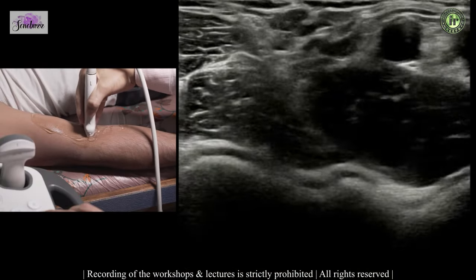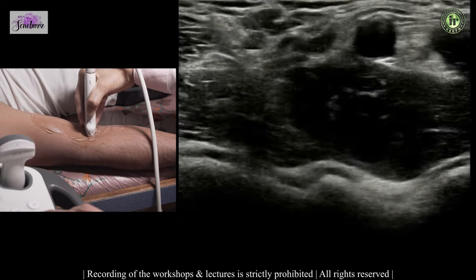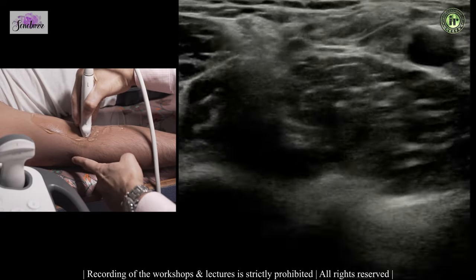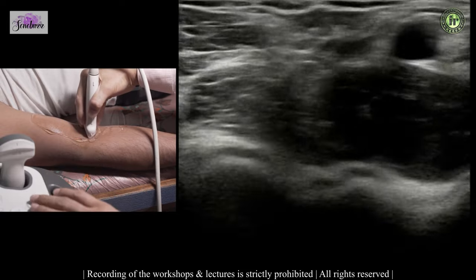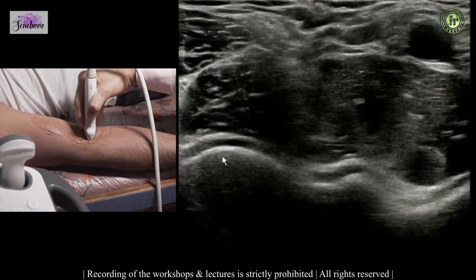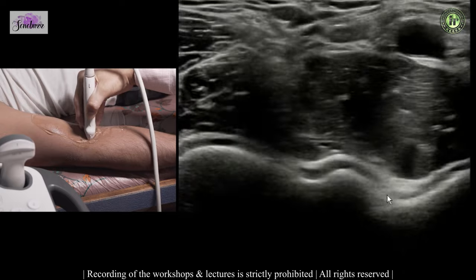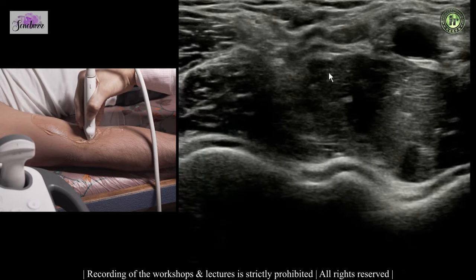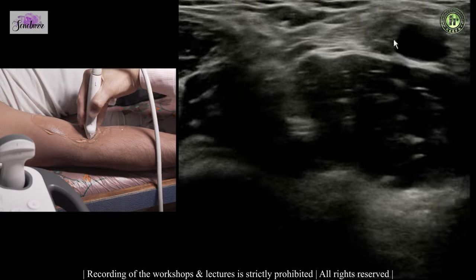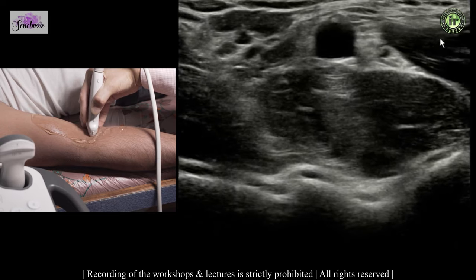In the next 12 to 15 minutes we will see how we scan the elbow from all four aspects. We start from the anterior aspect: after palpating the medial and lateral epicondyles, we keep the probe joining them in the cubital fossa over the distal end of humerus. In the transverse plane you see the lateral rounded capitellum and the trochlea. The brachialis muscle lies on the anterior aspect, on which sits the echogenic biceps tendon, medial to which is the pulsating brachial artery, and medial to that is the median nerve between the pronator teres and brachialis.